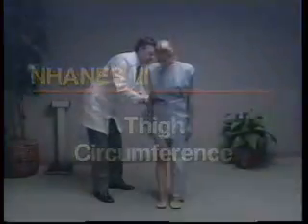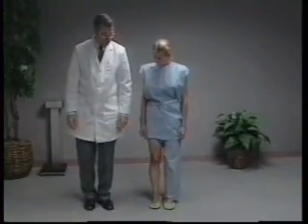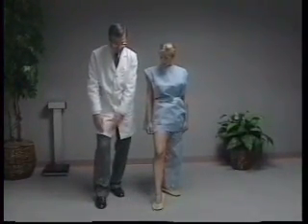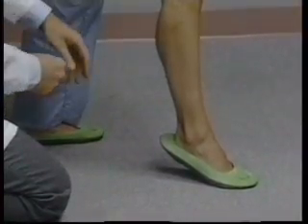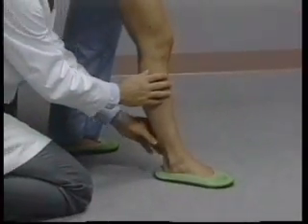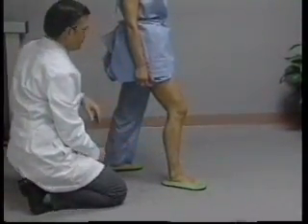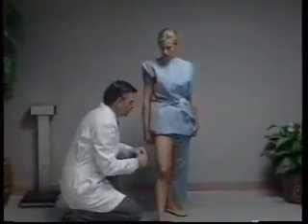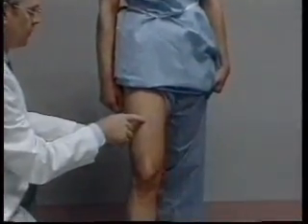For thigh circumference, a standardized position is required, and the technician best explains it to the subject through combined demonstration and instruction. The subject is instructed to step back with the left foot, which shifts the body weight to the left leg. The right leg is in front and bent slightly at the knee, with the soles of both feet flat on the floor. The right forward foot assists with balance but should not bear the weight of the body. The technician, positioned to the right of the subject, places the measuring tape around the thigh at the midpoint previously marked for upper leg length.